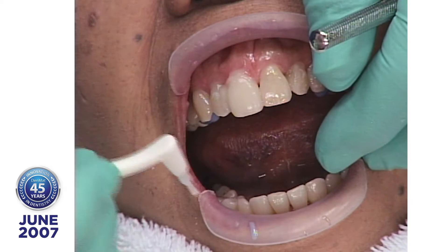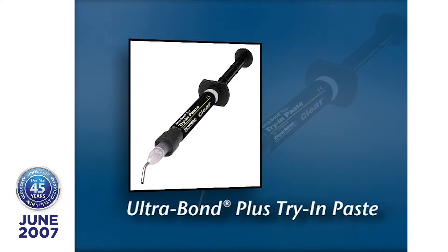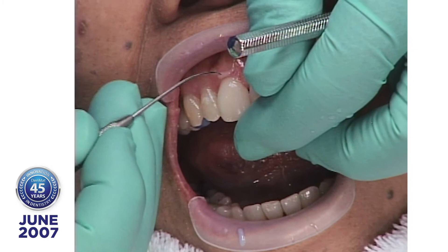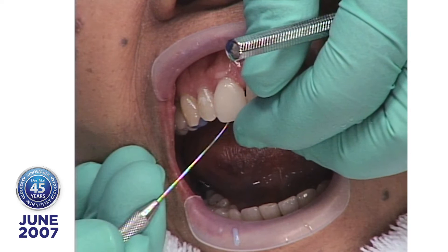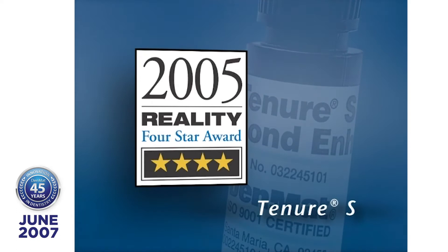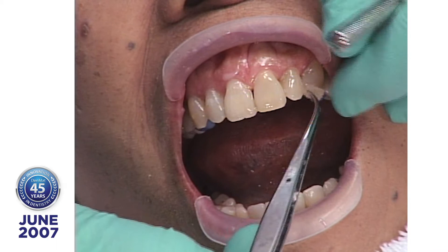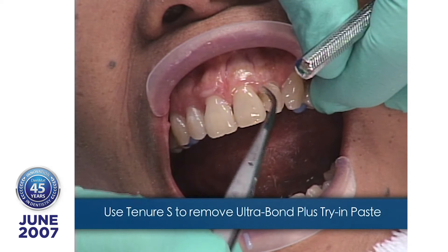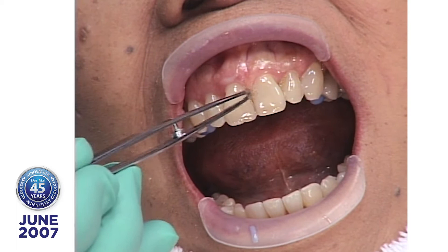We want to remove the Ultrabond Try-In Paste. Ultrabond Try-In Paste is exactly the same formula as Ultrabond, with one exception — it doesn't have any activator in it. When Lisa cleans this out, she's going to use Tenure S to wipe it off. If she doesn't get it all off the porcelain, the Tenure S will cause the Try-In Paste to polymerize. Once you put Tenure S on the teeth, you want to not dilly-dally, because Tenure S is your backup — if you don't get enough light in there, it will polymerize your resin.